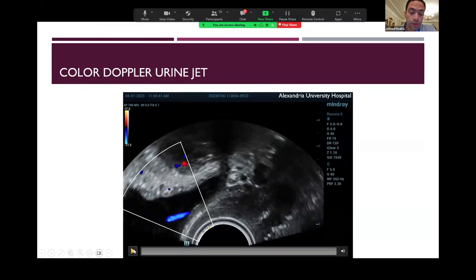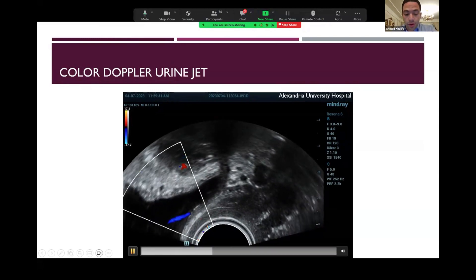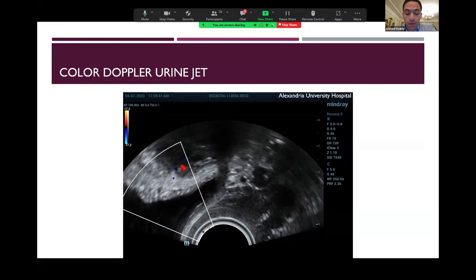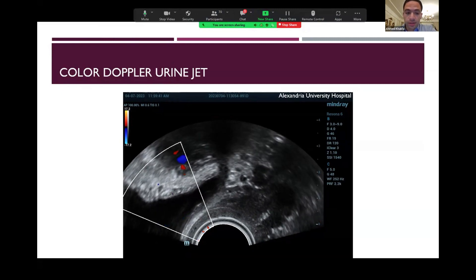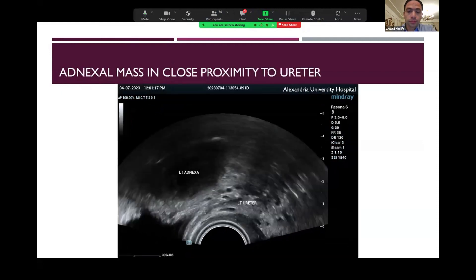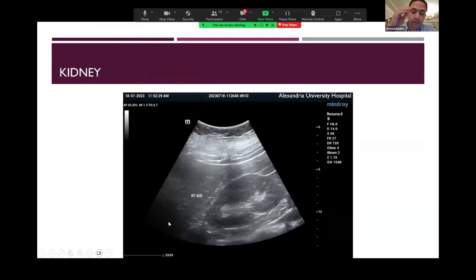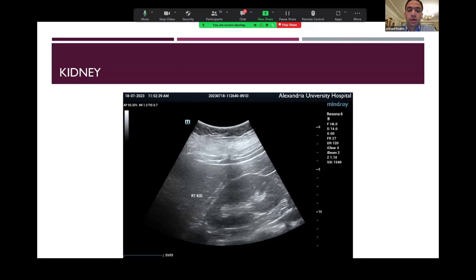You can also open the color Doppler at the side of the ureteric orifice while checking the urine jet into the bladder, which will give a signal by color Doppler. Lastly, we will check the right and left kidneys, which is very important because sometimes an intrinsic ureteric lesion will cause hydroureter and hydronephrosis, even if the patient is not complaining of any loin pain. Also, if there's any large adnexal mass, it can cause pressure on the ureter and back pressure on the kidneys.